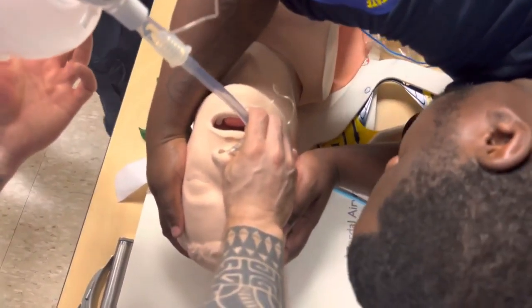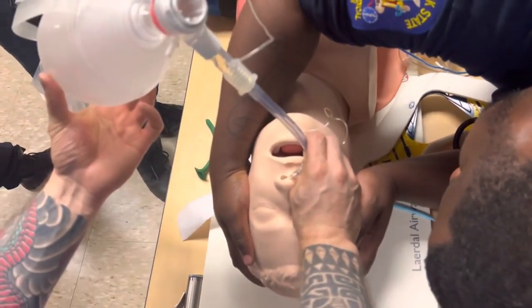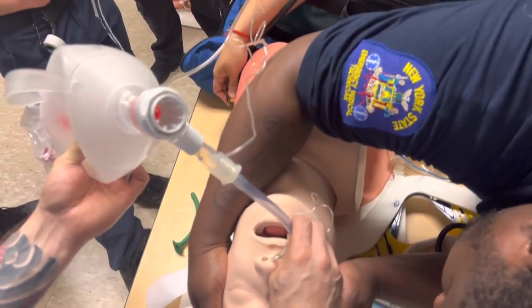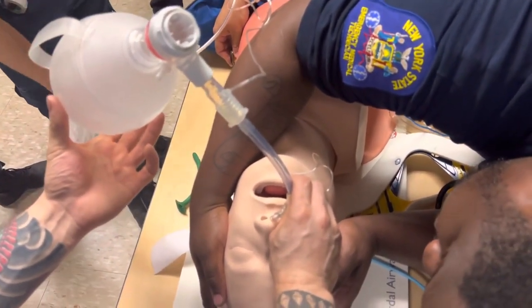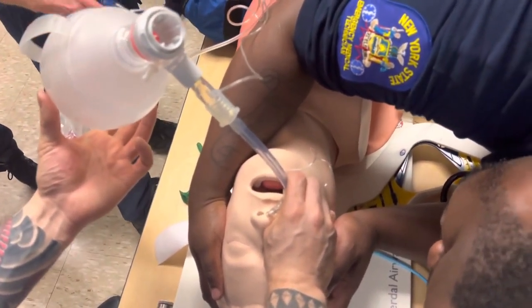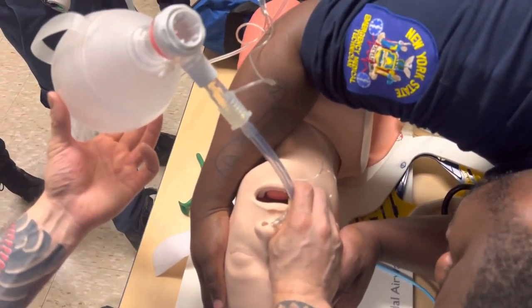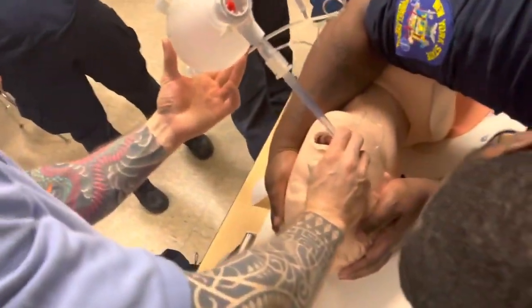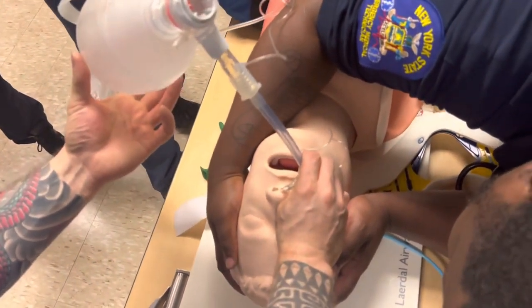Mid-axillary. Mid-axillary. Why is mid-axillary important? Because of the location? That's where the lungs are. So it's not per se the flesh. What if I put it too deep? Let's say I put it at the 27 mark. Centimeters at 27. What do you think is going to happen? It went to the right. Excellent, James, right? James says right.